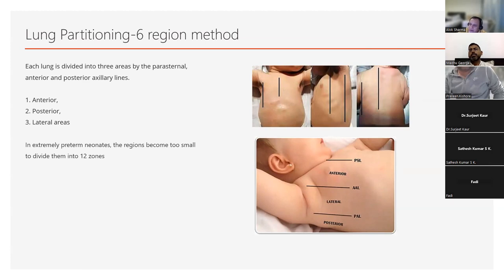But if you have a 500-gram baby, and you want to see the posterior regions, are you really, with umbilical lines and all of that, intubated, ventilated, going to put him prone in the first 2 hours of life? If he's not tubed and he's on CPAP, you can. But again, I'm just thinking of the handling, 22 weekers, 23 weekers. I mean, it's real trouble. Your golden hour basically is everything plus targeted head and targeted lung. And that decides whether you want to then give surfactant if they're not intubated. In our units, we tube everything at that gestation.